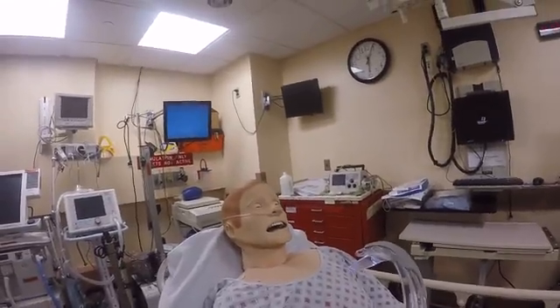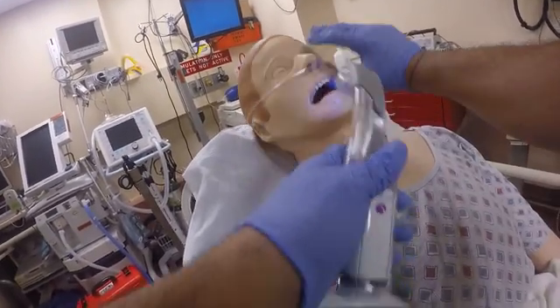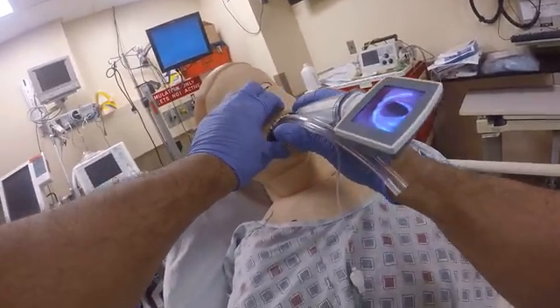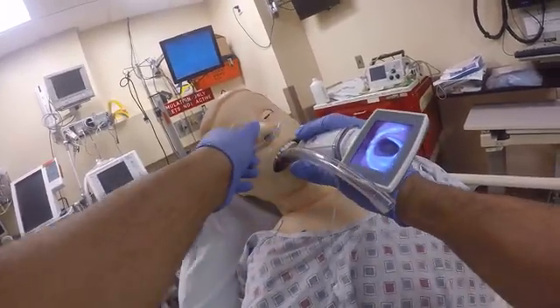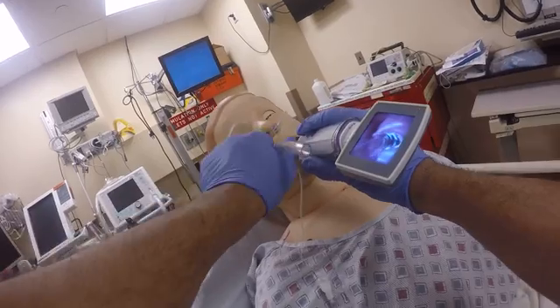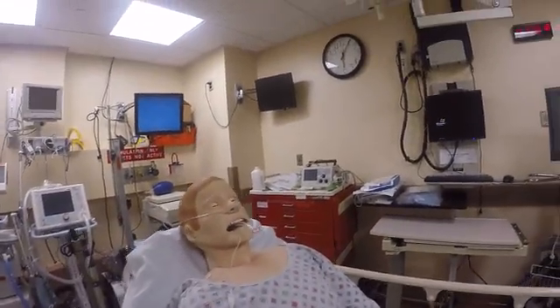Advantage of a channeled device — you don't have to use a stylet. The issue, as always, is opening the mouth. Open the mouth. Don't break teeth. Try to find the airway. It looks like I found it. Now it holds up to articulate — almost missed, almost got it. You have to get a good enough view that this tube will go in past the cords. Got it in. Disengage. A little bit of gag because I didn't sedate or paralyze him. And that's your intubation.